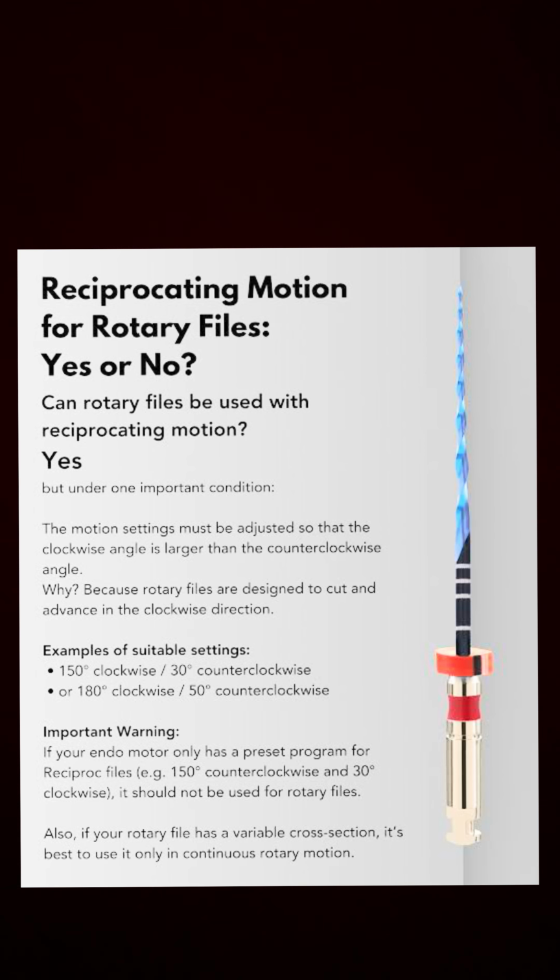Next one is the XP Endo Finisher, which is used to maintain the original canal anatomy. It adapts to the irregular canal. It reduces fracture risk and is efficient in curved canals.